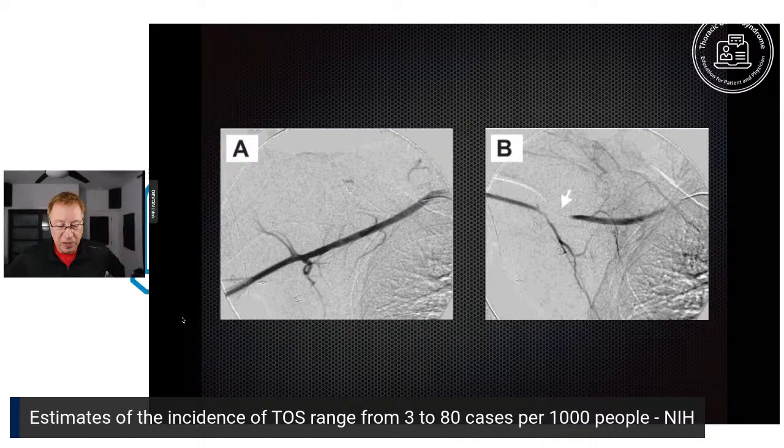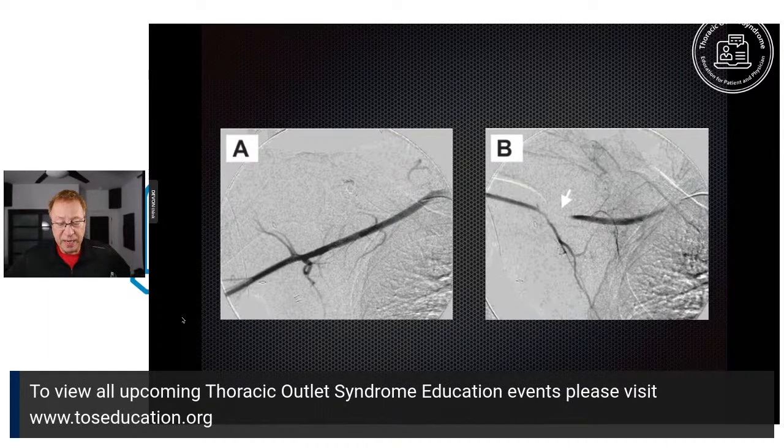All right, on the left, the arm is down. On the right, the arm is up, and the artery is compressed from outside. This is one type of arterial TOS. You'll also notice that to get the big picture of the artery, you have to kind of erase the bones. So really, you're getting as pure a picture of the artery as you can. But that means you cannot easily assess what are the other structures that are pressing on that artery.